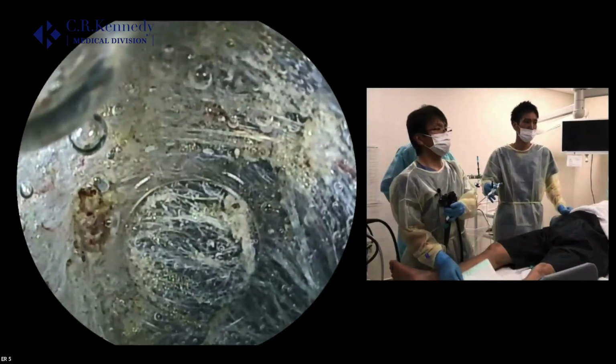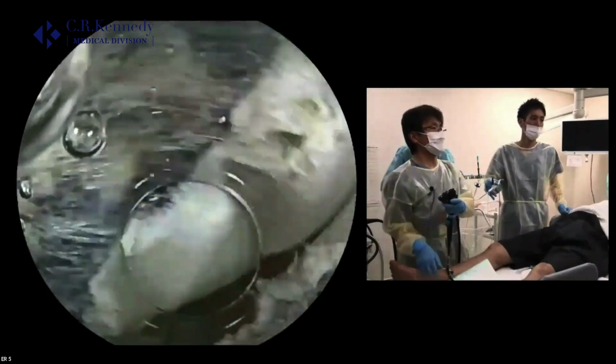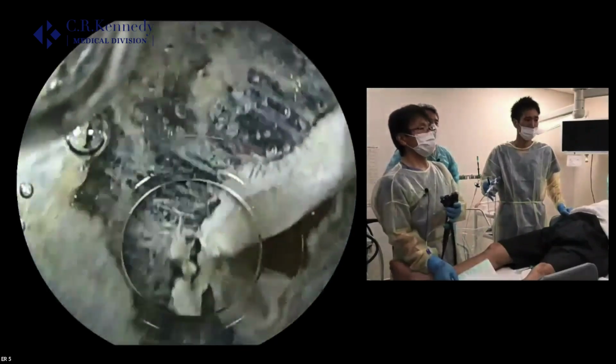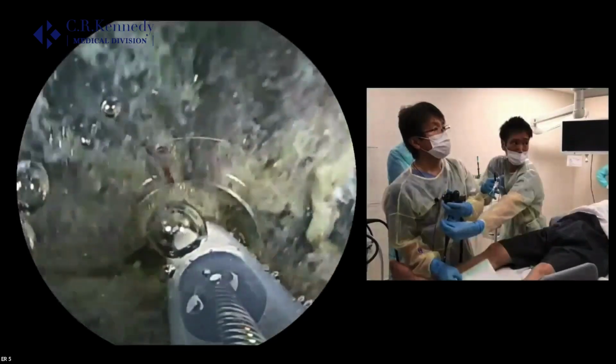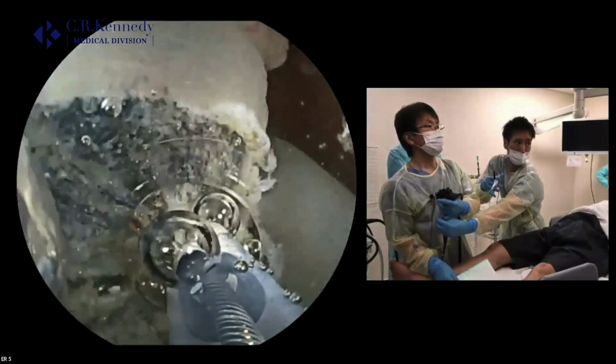I was explaining how to go outside of the pocket. Yeah, estimate the outlet of the pocket and go up to the mucosal side and go out of the pocket. That's what I was explaining. Anyway, cutting the right side.